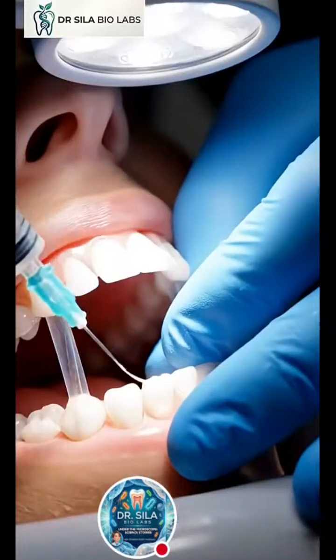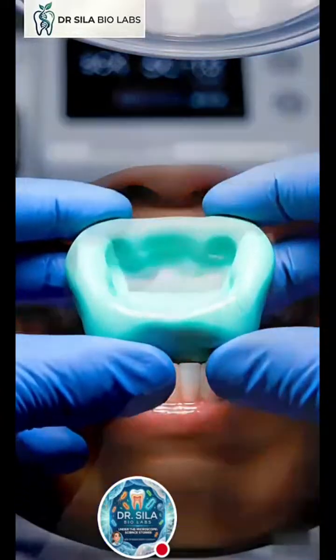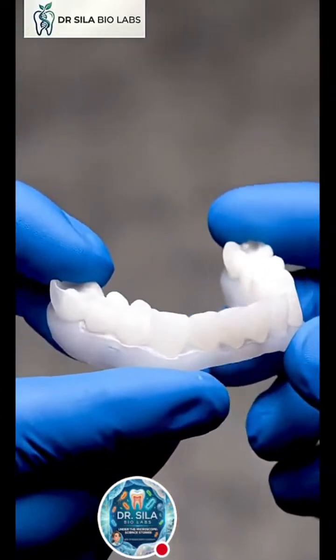The core of each tooth is rebuilt using advanced composite materials. The rebuilt teeth are precisely shaped to support the future bridge. An accurate impression is captured to fabricate a perfectly fitting zirconia bridge. The custom zirconia bridge is now ready for placement.